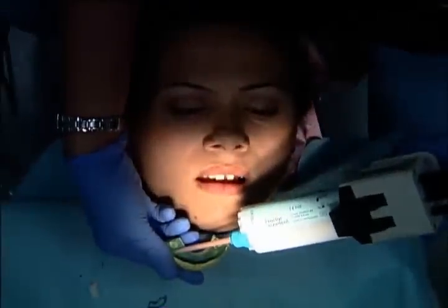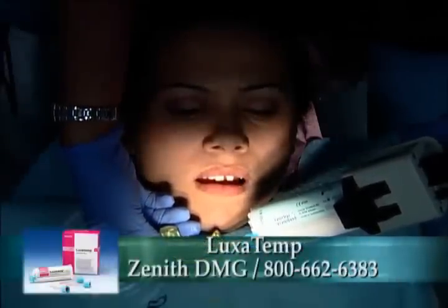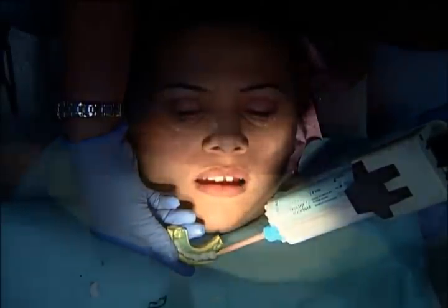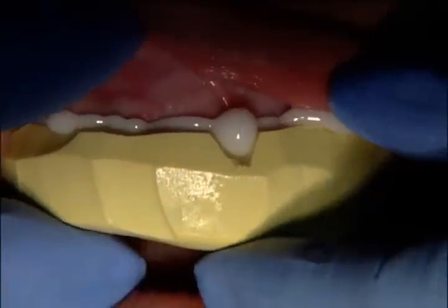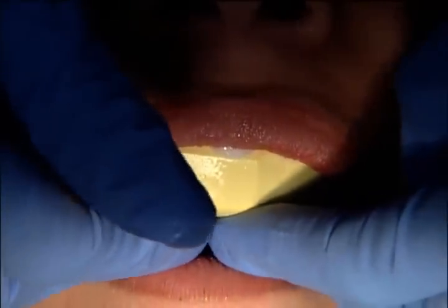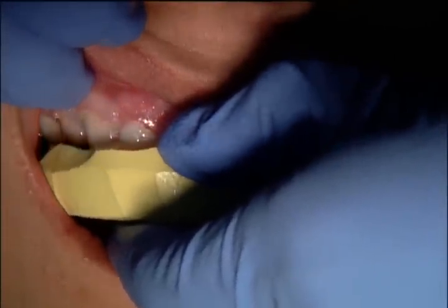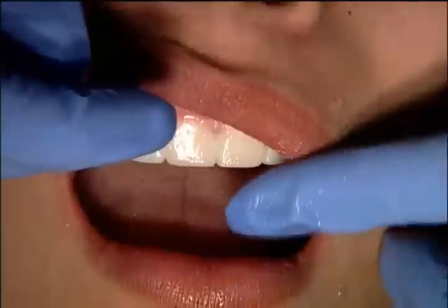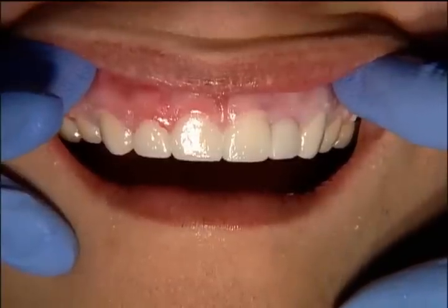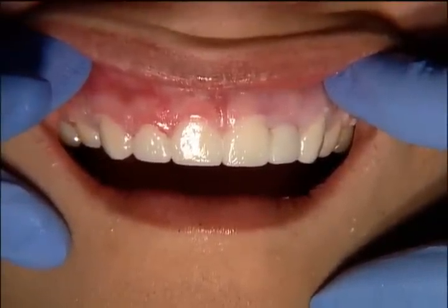Once the putty wash matrix is completely set, I'm squirting temporary material into it — this is Luxatemp, and they make a bleach shade for really thin veneers. This happens to be B1. I've put a notch in the midline so I know exactly where it goes. We seat it because the putty wash matrix covers several molars we're not prepping, giving a firm, positive seat. We take this off after three minutes. I never stop being amazed when I take that putty wash matrix out and see how good those temporaries look and how little finishing they need. Provisionals for veneer preps was once so difficult — this is really the best way and produces some of the best-looking temps we have.